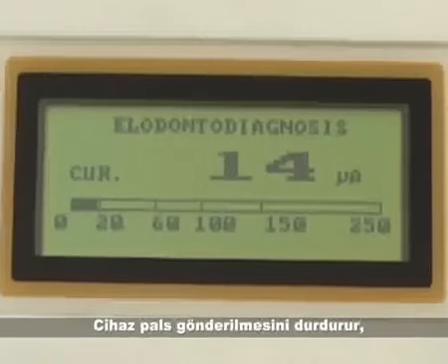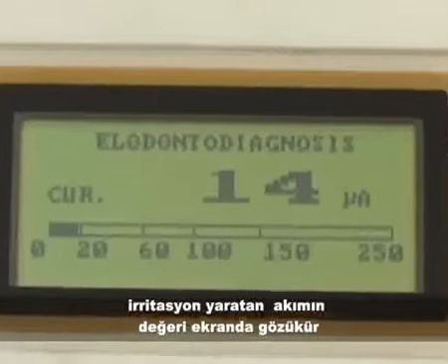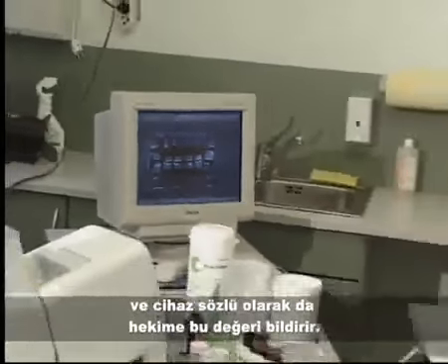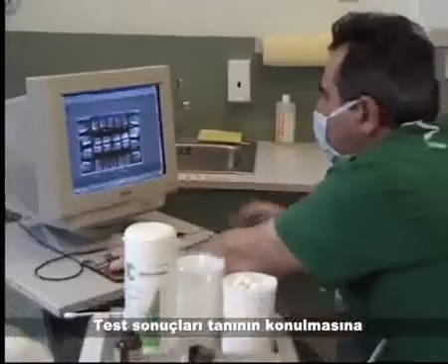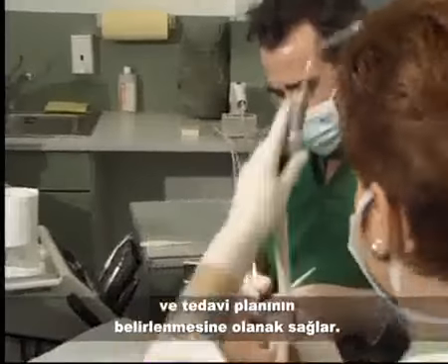The device stops the transmission of impulses, indicates on the display the value of the pulsed current which has caused the limit irritation, and announces the results to the dentist. Examination results give opportunity for diagnosis specification and treatment plan determination.